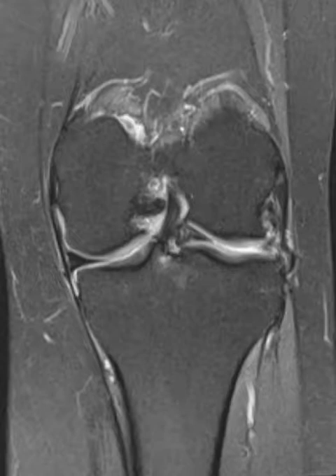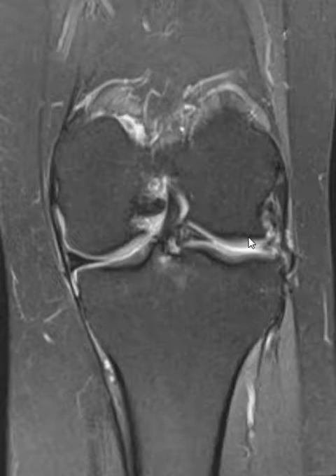Hello, this is Dr. Gay from First Look MRI, and this is just a bread and butter case of meniscus tears on both sides. The medial and lateral menisci are torn. The patient was born in 1963, and these are just common meniscus tears that you see over and over again, so it's important just to be able to catch them really easily and quickly.